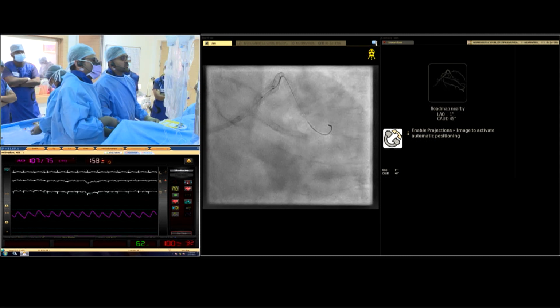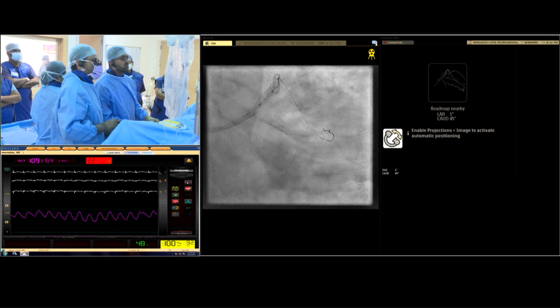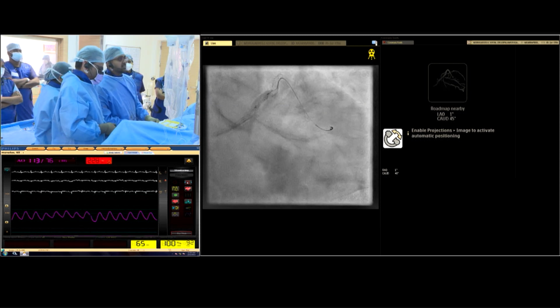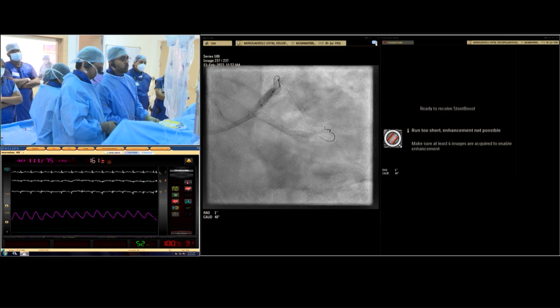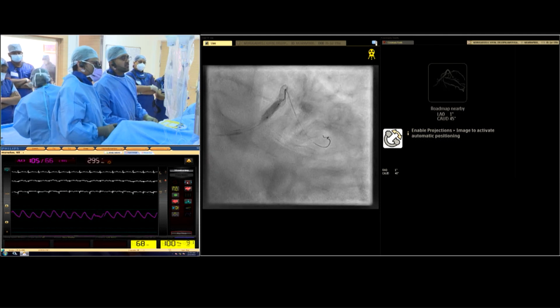I think one of the good things about this stent is the visibility, the fluoroscopic visibility. It makes a big difference. Okay, go. Because every time I'm pulling my balloon back, the guide always gets sucked in. You really don't want to damage the proximal stent in the left main, which essentially is hanging because we have not optimized it. Okay, down.